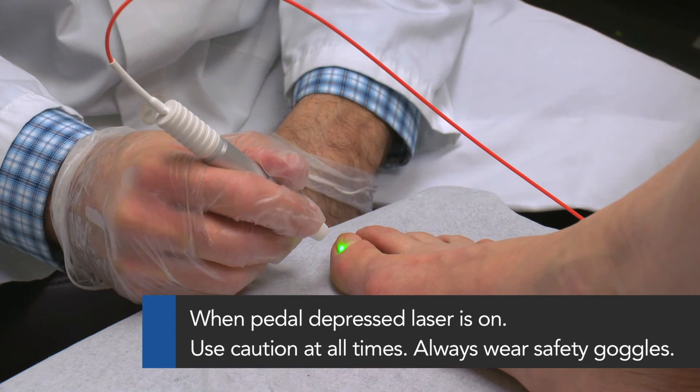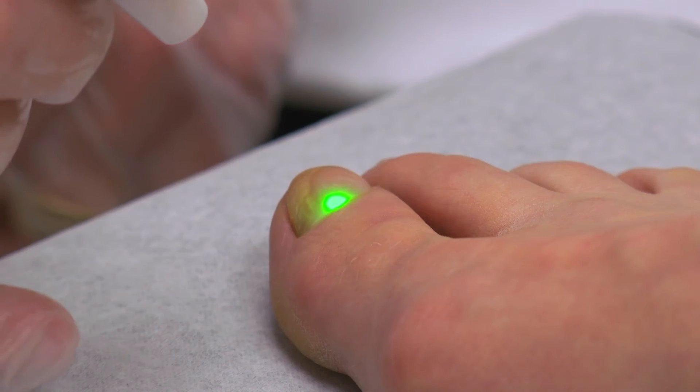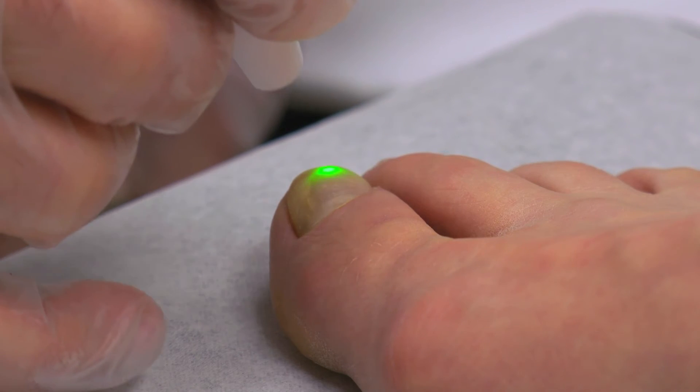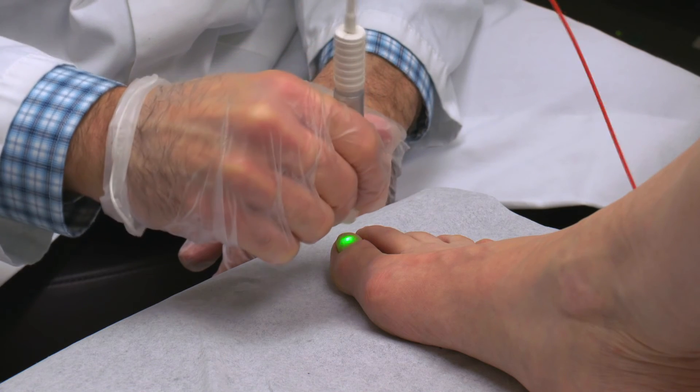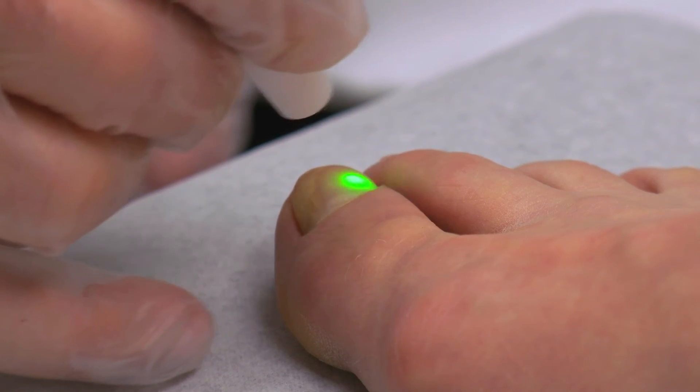Depress the foot pedal to turn the laser on and start with a grid pattern, first moving the laser up and down across the nail and back again, and side to side, moving from the end of the nail to the cuticle and back again.